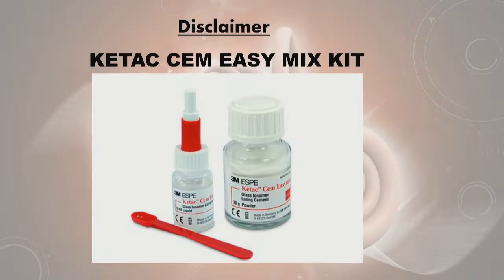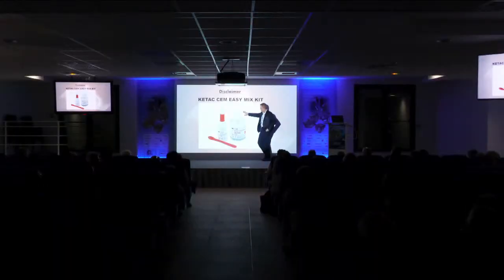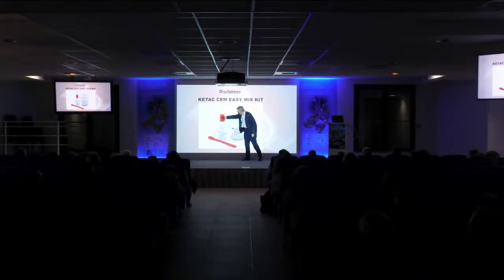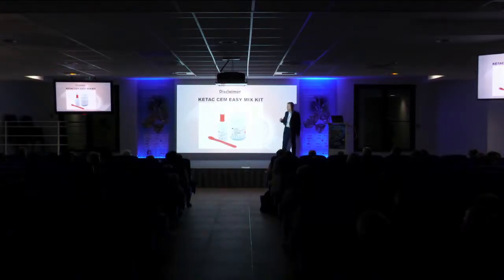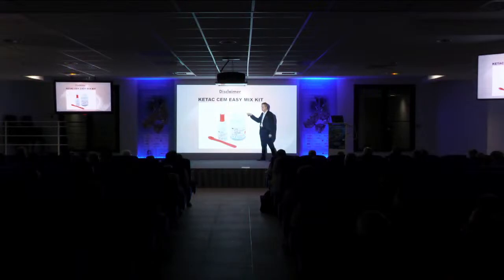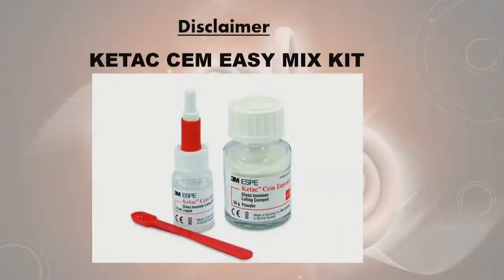And what we have here is, let's see if the pointer will come up. You've got the little spoon at the bottom here, and so these are products that are off the table. This is then sterile, just the lid with the handle, and the spoon is sterilely packed, and then that is gas sterilized, and then I get given that on my tray. I then take the spoon, the sister just holds this, and I will scoop a little bit of cement, and then the dropper is turned around. I screw that on and just drop 2 drops on.